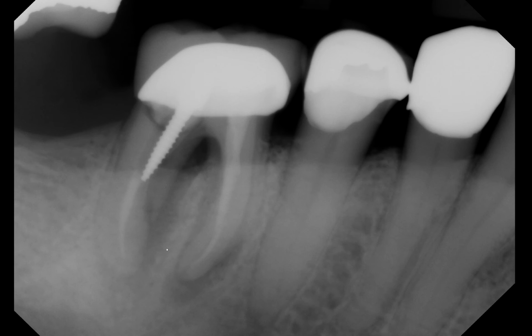So this radiograph was taken in 2015, and this tooth was actually extracted in the summer of 2016, so 3 years ago. So now we're going to fast forward to present day and take a look at how this site appears after 3 years of healing. Keep in mind that this patient is an 87-year-old male, and let's see how this area looks.